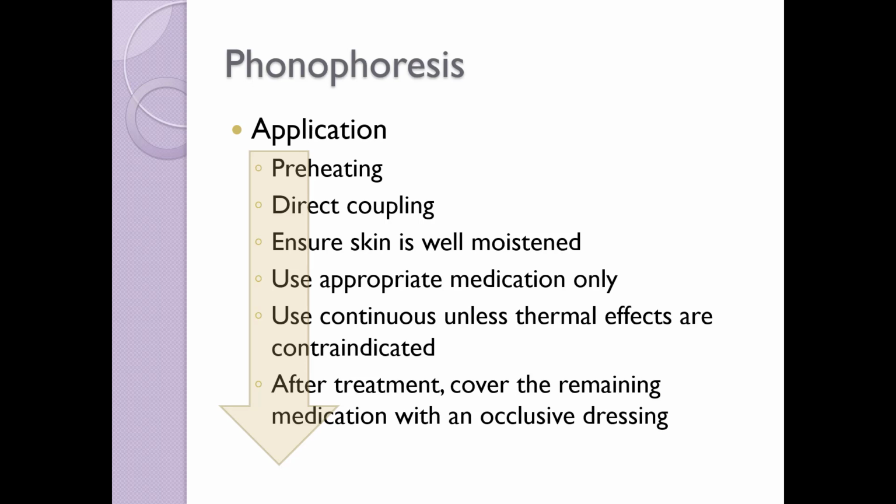Unfortunately, the efficacy of phonophoresis has not been fully substantiated. Many research articles have suggested that there is very little evidence that the medication actually reaches the target tissue. Some new research has been conducted utilizing low-frequency ultrasound of 20 kHz on animals. The 20 kHz ultrasound increased the skin permeability 1,000-fold over that of 1 MHz ultrasound, and therefore the ultrasound frequencies commonly used for therapeutic purposes on humans may be too high to be effective for phonophoresis.